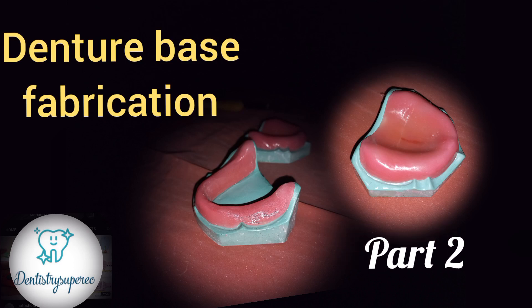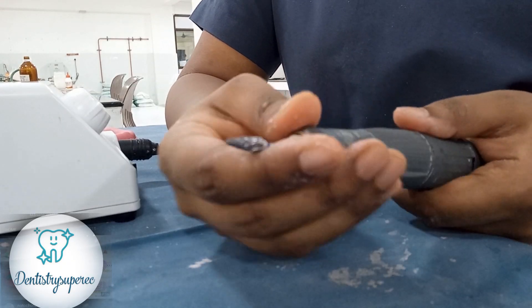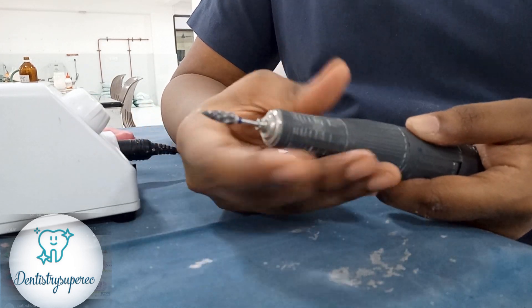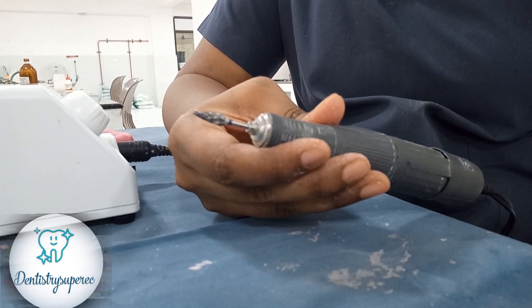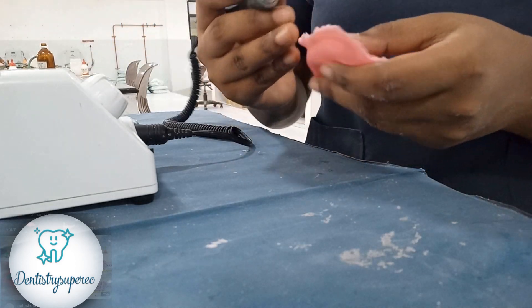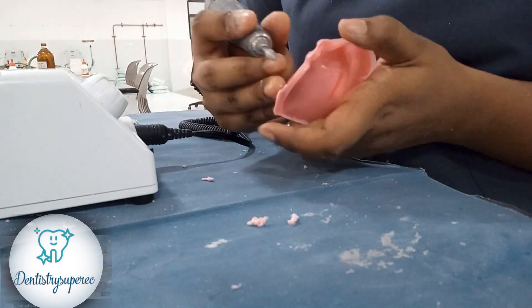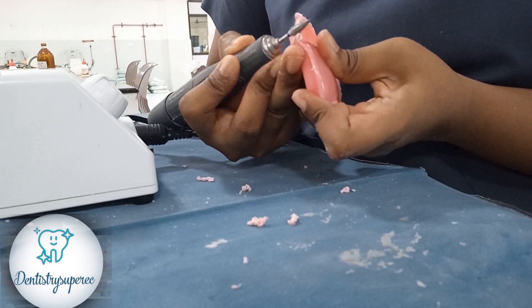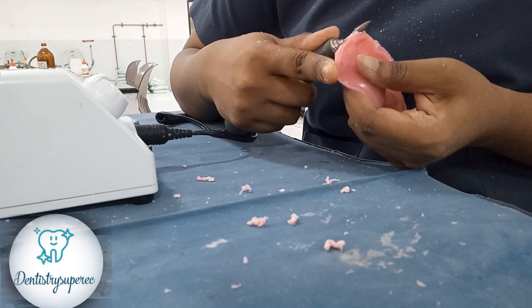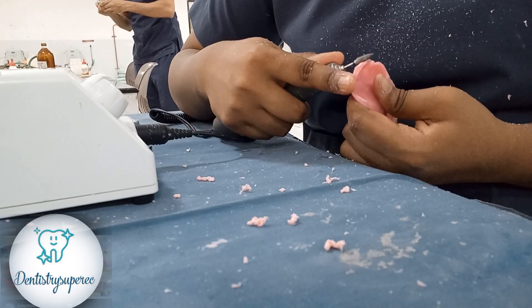Today we are going to see the trimming and polishing of the denture base. We are using the marathon motor trimmers and acrylic burs for trimming. Initially we will be trimming off the excess wings from the denture base — sprinkle-on method. We can cut it before it sets hard, but I am more concerned about the finish and the thickness of the denture base, so we trim it off later.